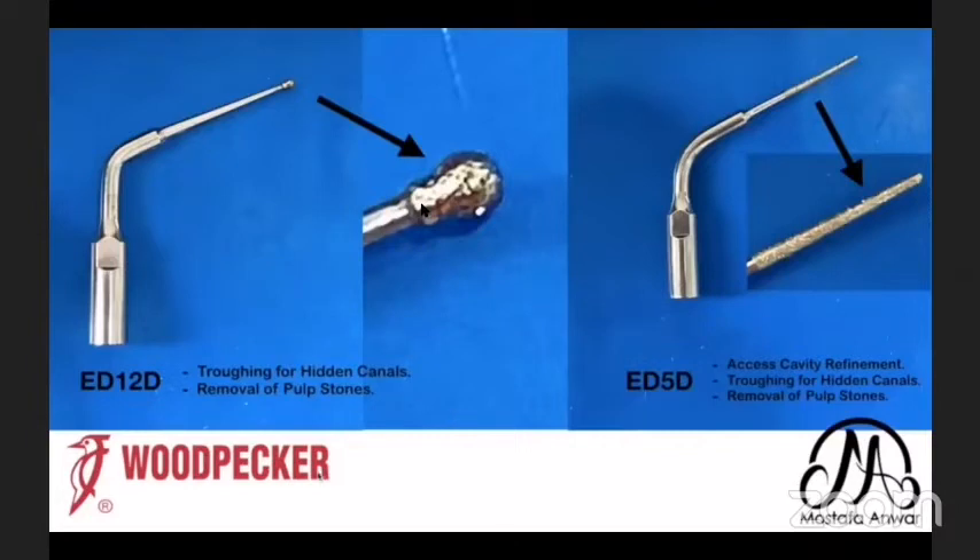My other tip is ED12D — I call it my Joker tip because I can use it for many steps in root canal treatment: troughing of hidden canals for MB2 and middle mesial, removal of pulp stones, removal of cement around metallic posts, and removal of fiber posts. The last tip is ED5D, which looks like a tapered stone with rounded end but is much smaller in size. It can be used for access cavity refinement, troughing for hidden canals, and removal of pulp stones.